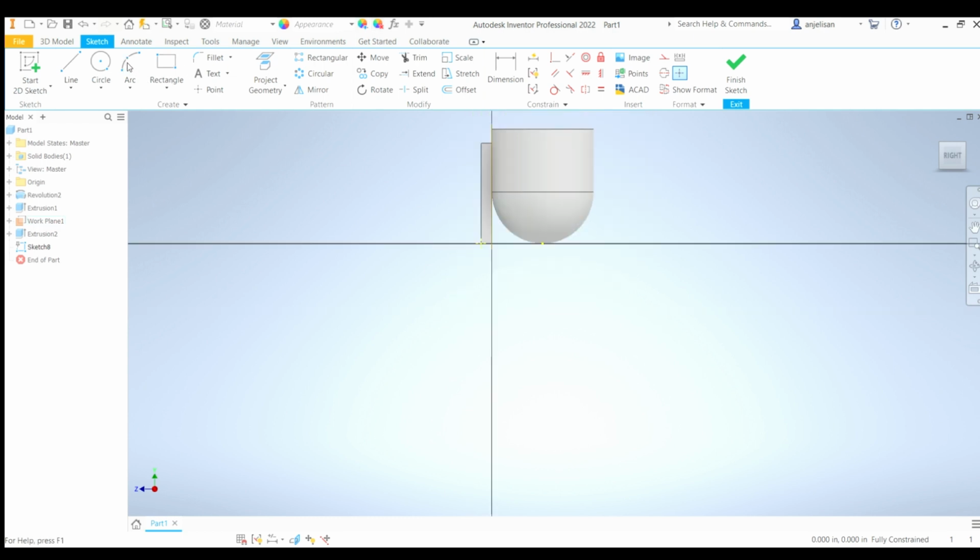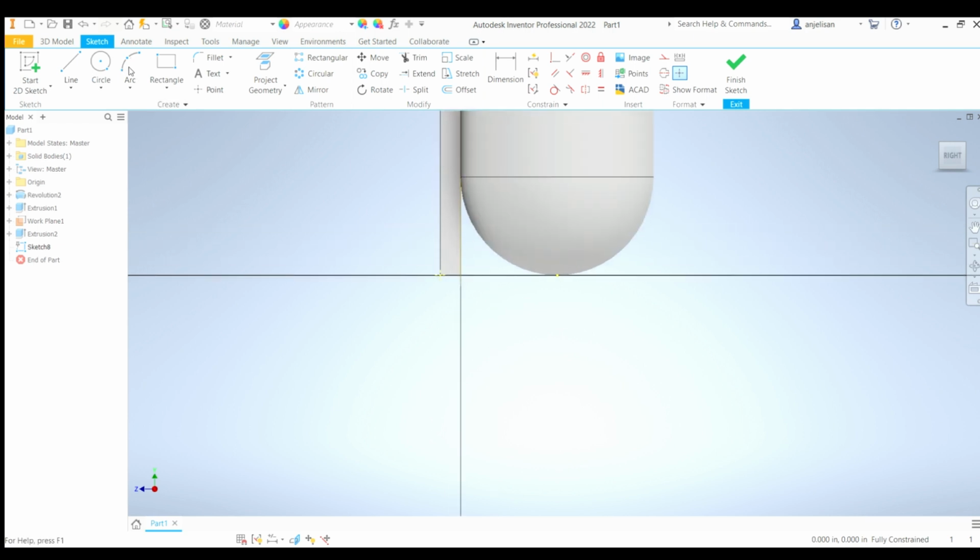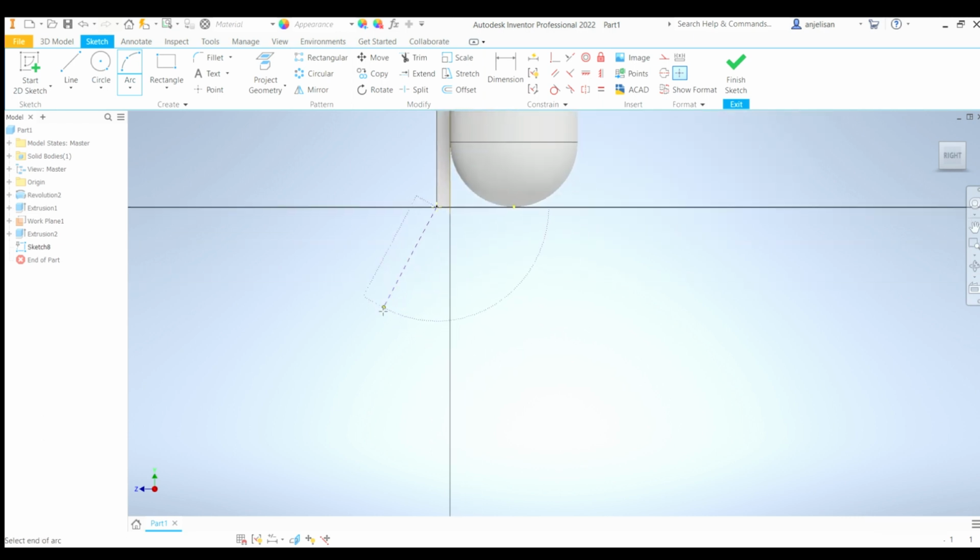Okay, so now what we want to do is create our arcs so that we can make the J shape. We're going to make a 3-point arc, starting at the bottom corner of this rectangle, this bar. We just click, and then let's click somewhere over here. I'm not sure why it didn't click. Okay, and then somewhere over here, so that it's kind of curvy. That looks fine. And then let's make another arc from the last point that we clicked to here. Okay, so this looks okay.